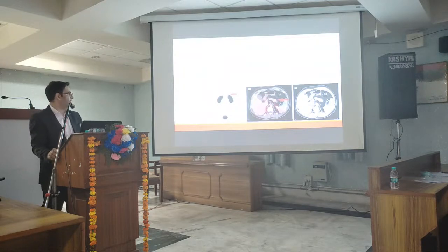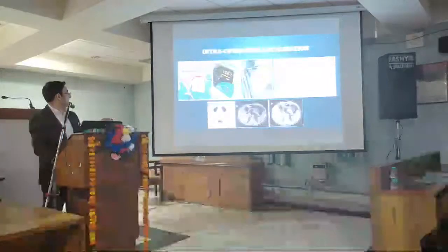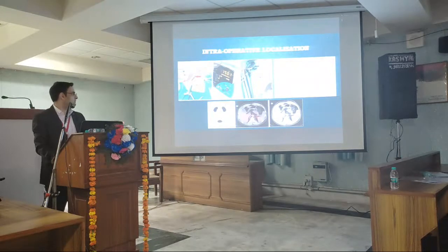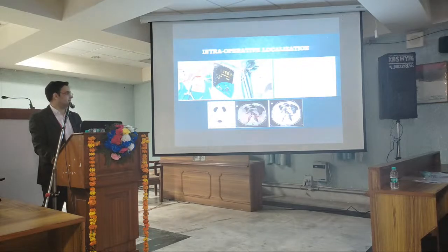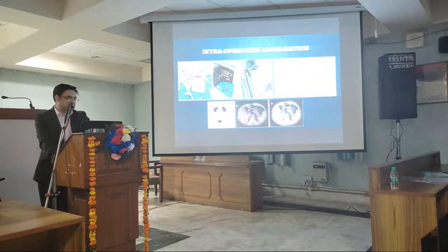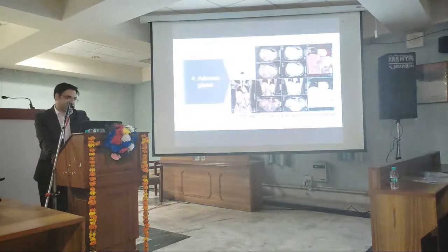So this is a patient with insulinoma in the body and tail of the pancreas, and this is the intraoperative probe. We localize the adenoma with the number of radioactive counts there, and the adenoma was removed. Later on, this is the post-excision state, checking multiple times for residual in the pancreas. So it is greatly helpful for the surgeon as well as the patient.